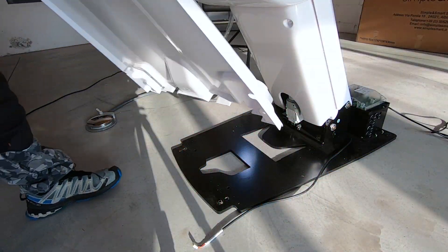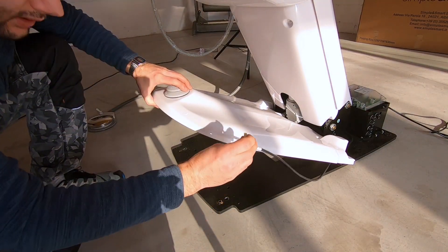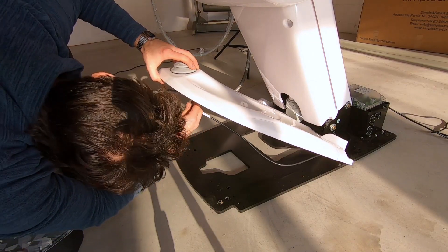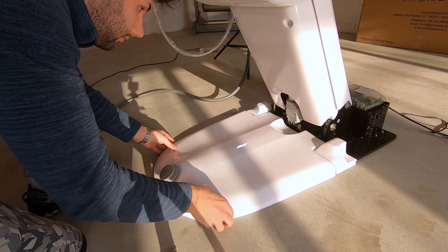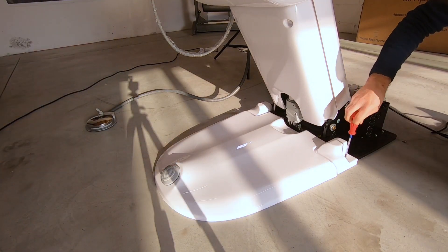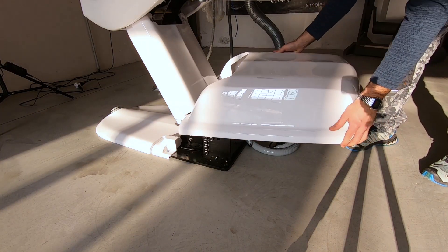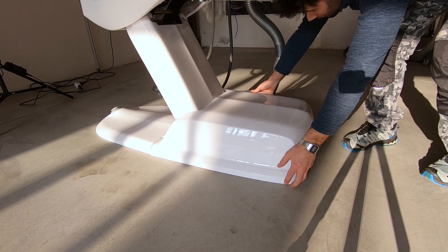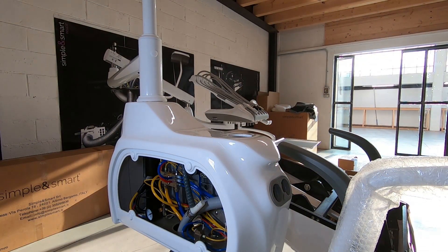Put back the rear chair base cover. Reconnect also the movement pad and close its two screws. Place the other chair base cover. Put the silicone ring on the water unit.